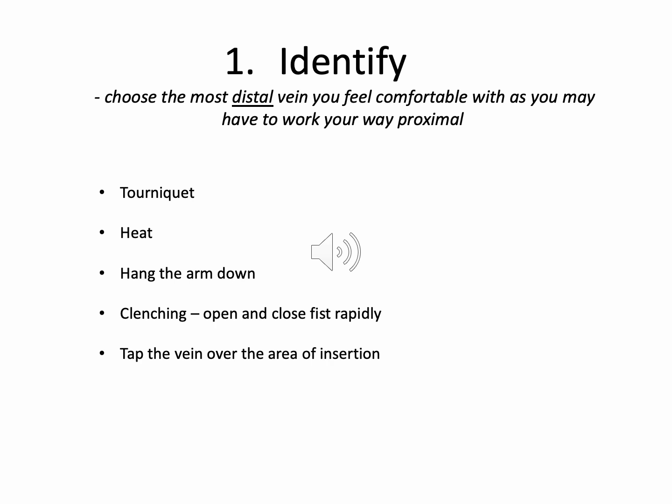In the cold hand situation, it may be worth getting the patient to warm up their hands by wrapping them in some warm clothing or blankets, or indeed immersing them in some warm water while you step away for 20 minutes to half an hour and come back.